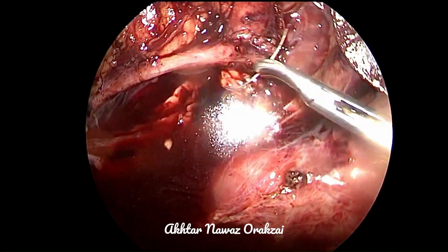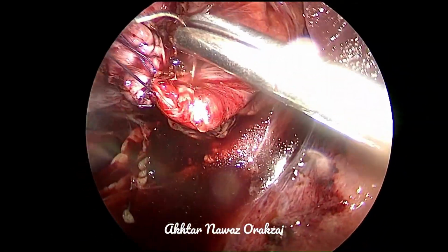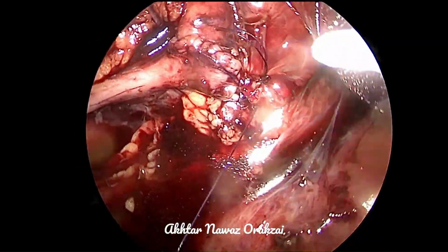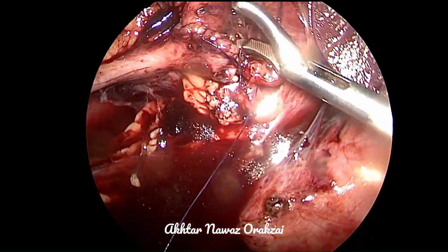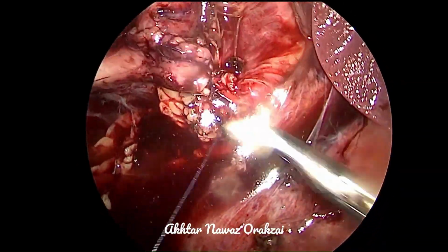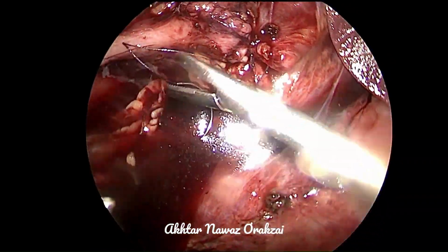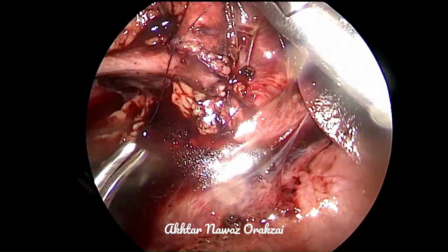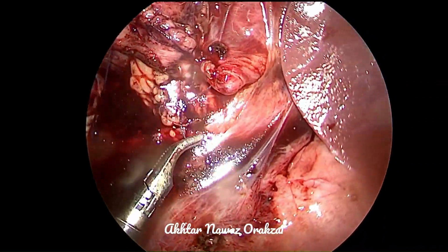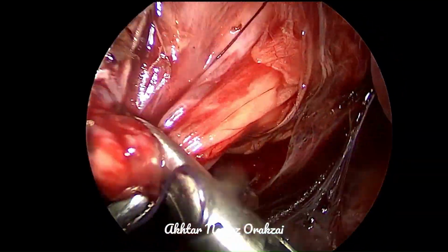So talking of the principles here, you can see that the vascularity is well maintained of the ureter as well as of the pelvis. Number one. Number two, the anastomosis is not under tension. You can see the ureter is lying relaxed and the pelvis is lying relaxed. So if there is any disparity, try not to mobilize the ureter for more than 5 centimeters.